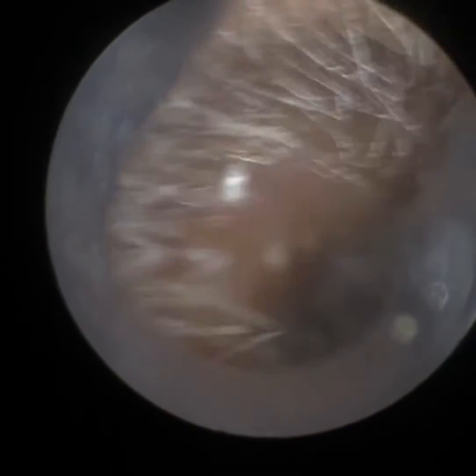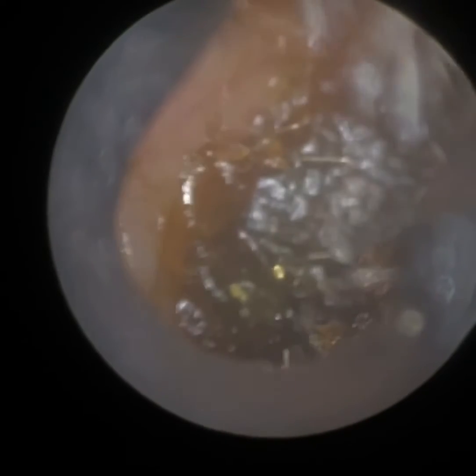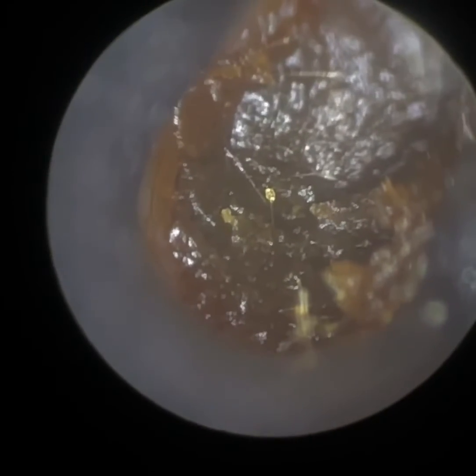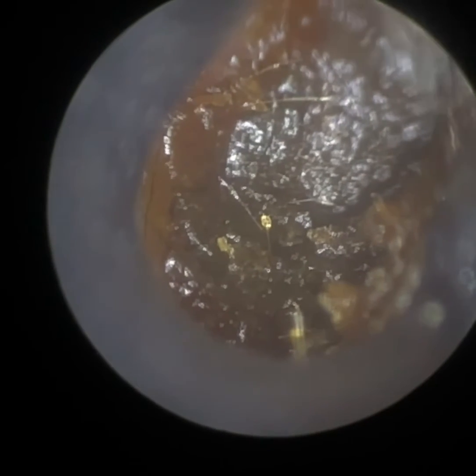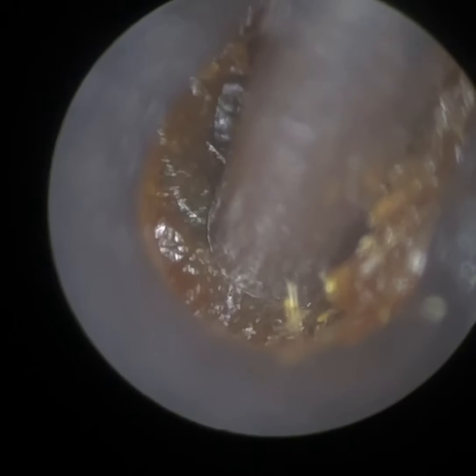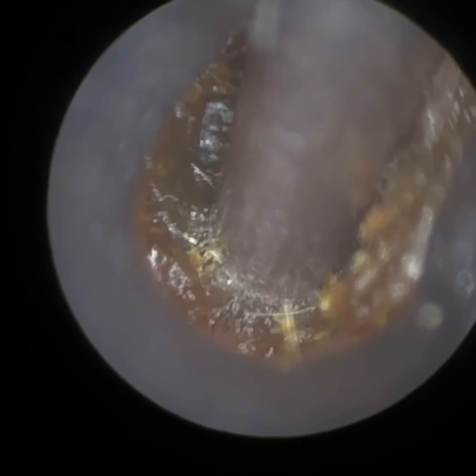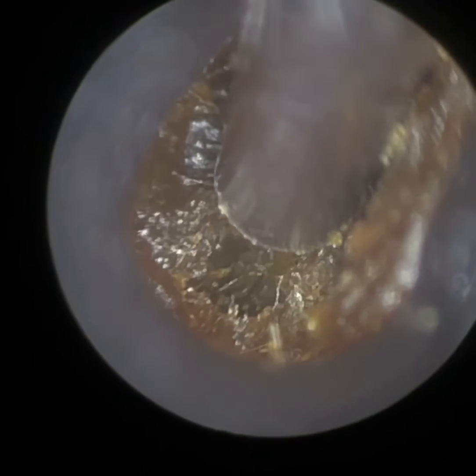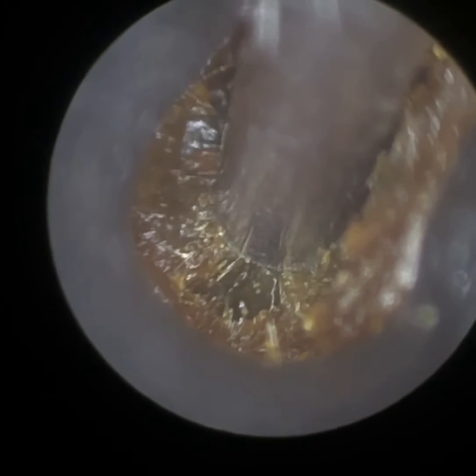This patient attended with bilateral, fully impacted medial earwax — you may be able to see it — and they'd used a cotton bud. We're just commencing with their right ear. This ear was extremely painful, the patient was extremely anxious as well, and they were unable to sleep yesterday due to the pain in their right ear. We've discussed the risks of using cotton buds.